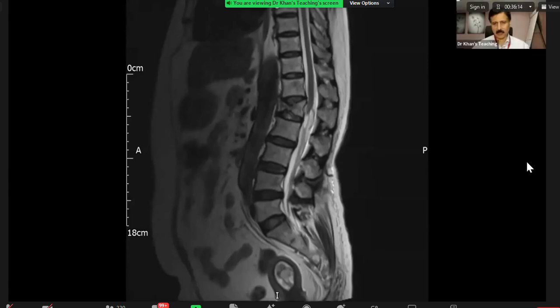Very good. What will you advise for that? So for the endometrial cancer, I'd recommend an MR pelvis gynae protocol to further assess the lesion and a CT thorax, abdomen and pelvis to stage the cancer.